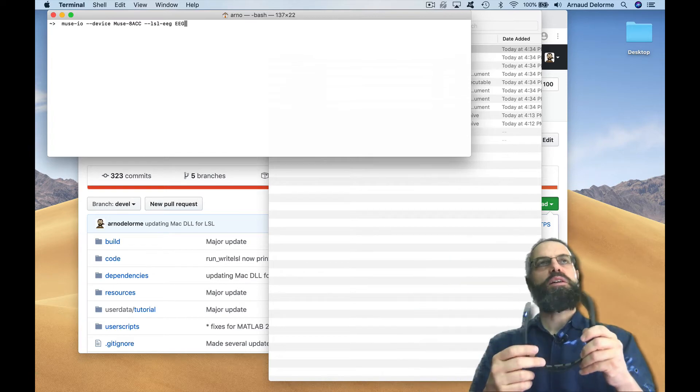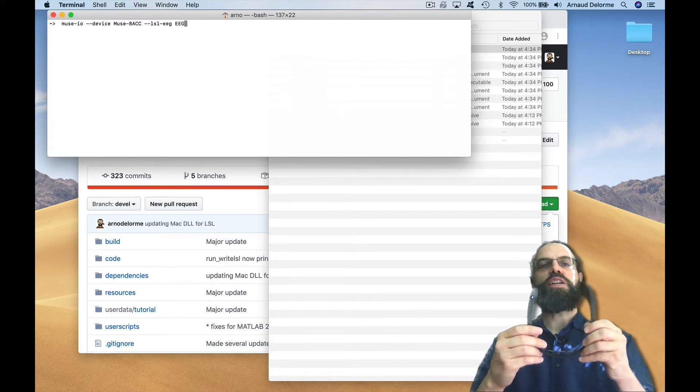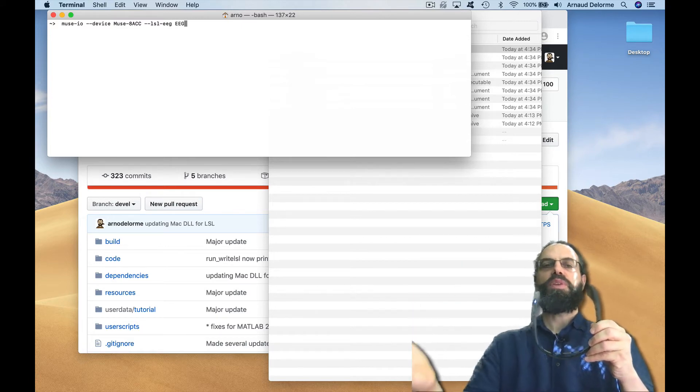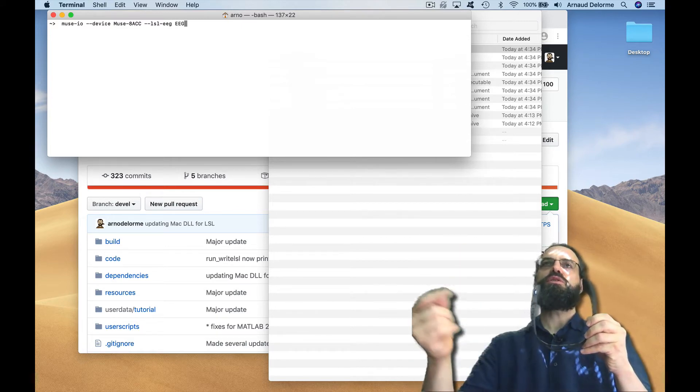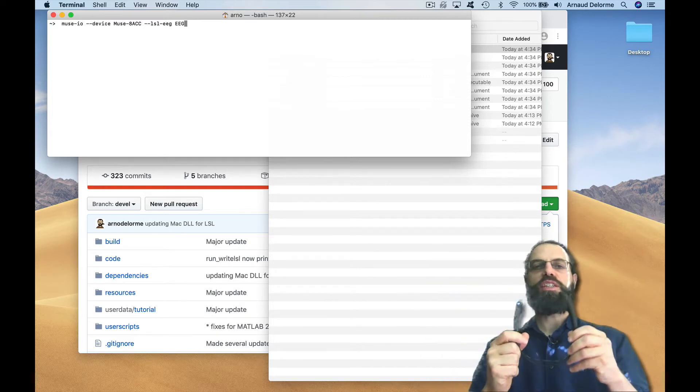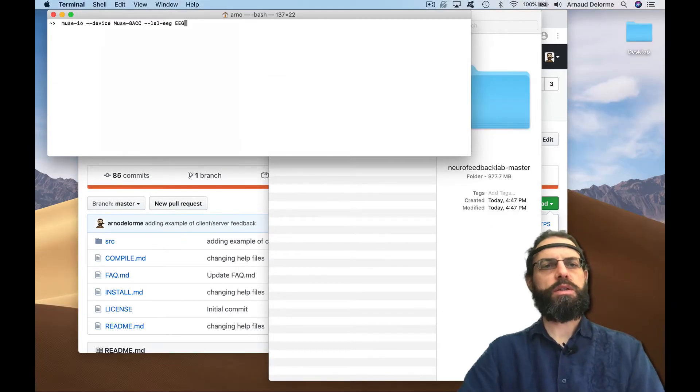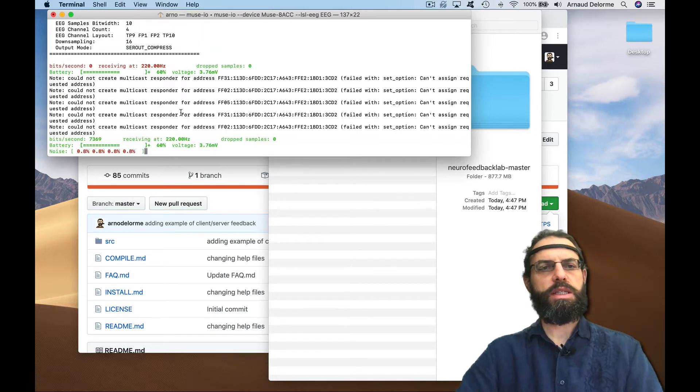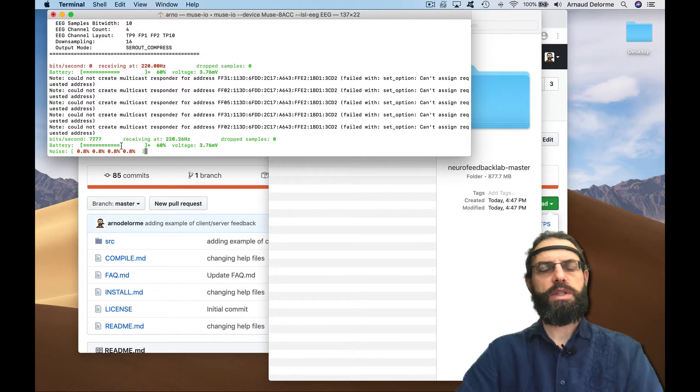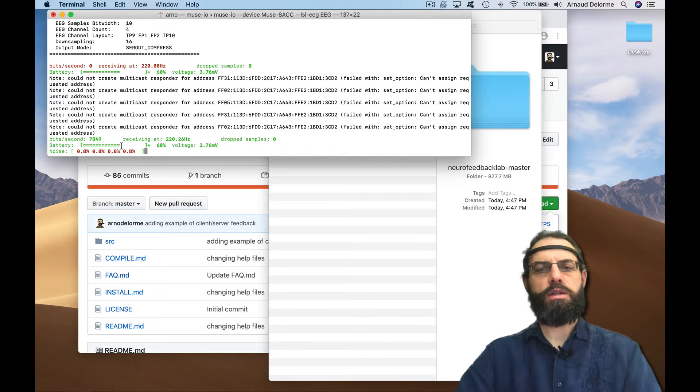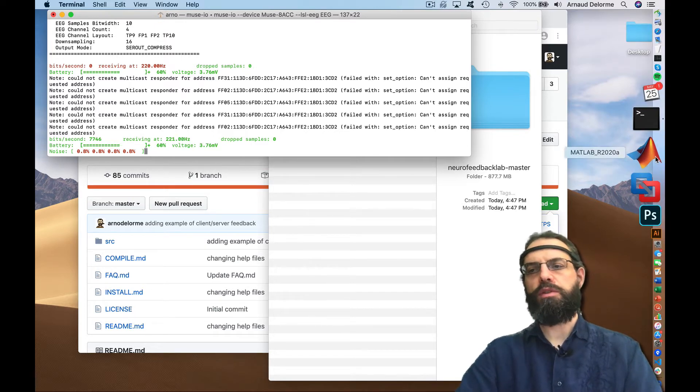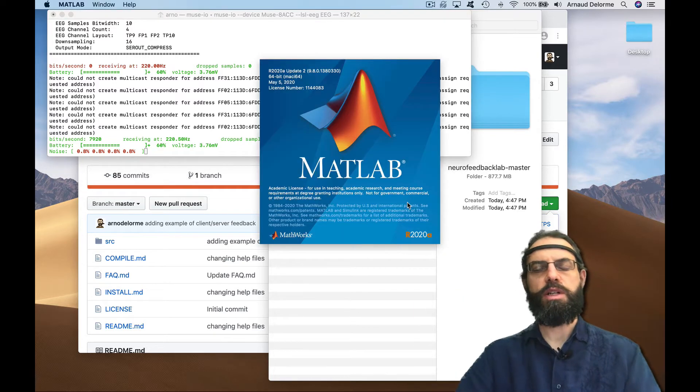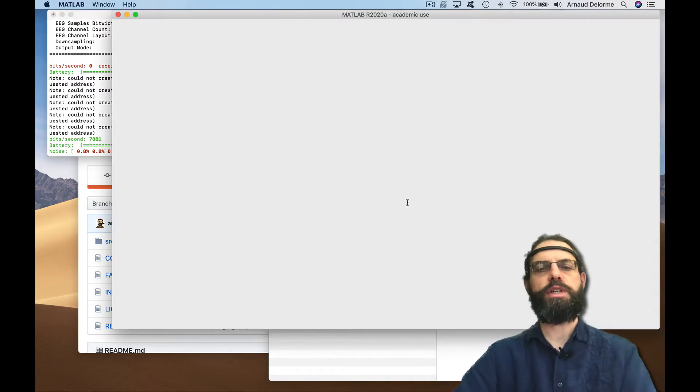I think there's about 30 different EEG systems you can connect with and stream data using this protocol. Once the data is connected, we're going to use Neurofeedback Lab to connect to that stream. I'm going to use that command to connect the Muse headset. It's trying to connect. Okay, it's connected. It says 60% battery and the connection is pretty good. Now it's streaming the EEG stream on my computer, so I can connect to that stream either on the local computer or on the local network if your firewall allows for it.